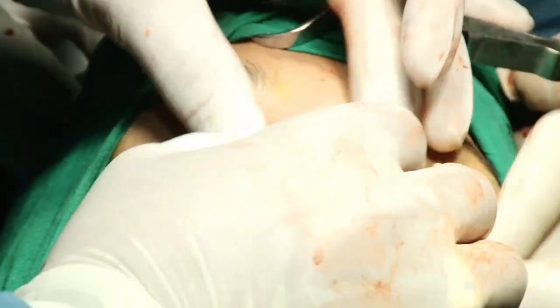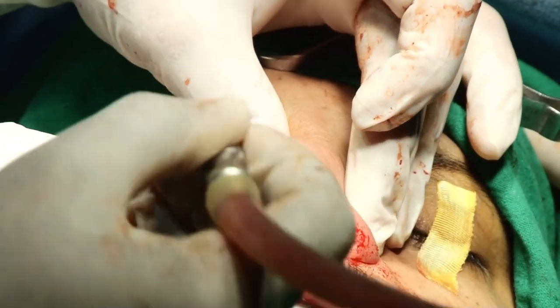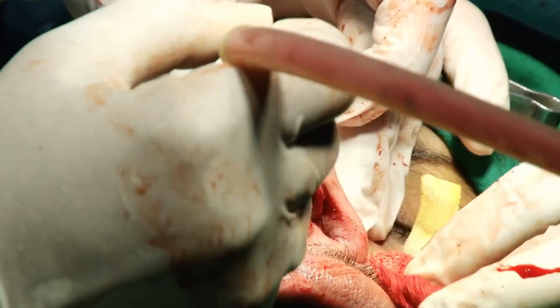So you need lateral osteotomy on both sides? Yes, both sides, lateral osteotomy. So you need paramedian osteotomy?